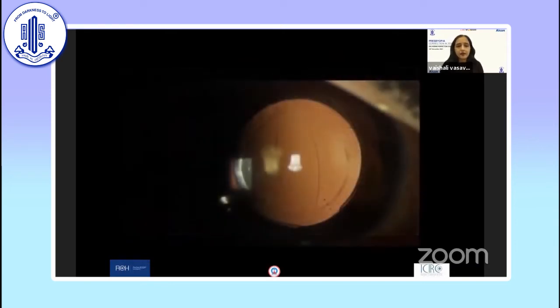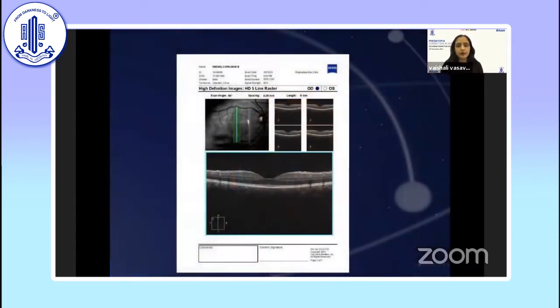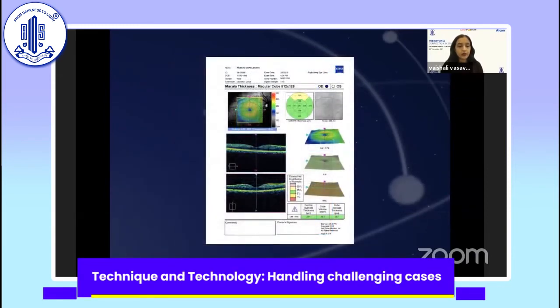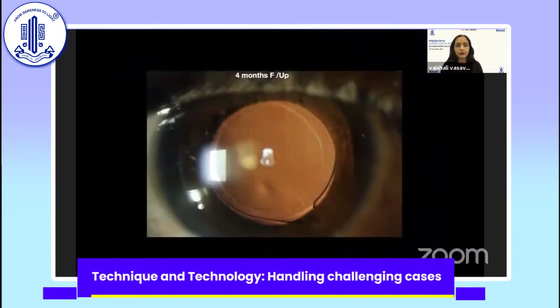And this is what the patient looks like post-operatively, because it's important to see what actually happened. Intraoperatively, it's fine, but also post-operatively. So my message here is that post-operatively we need to monitor these patients, especially the retina, and the OCT looks very good. And indirect ophthalmoscopy periodically is also very, very important. And this is 4 months down the line.